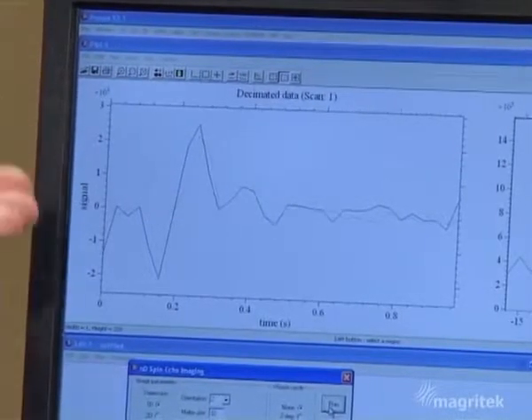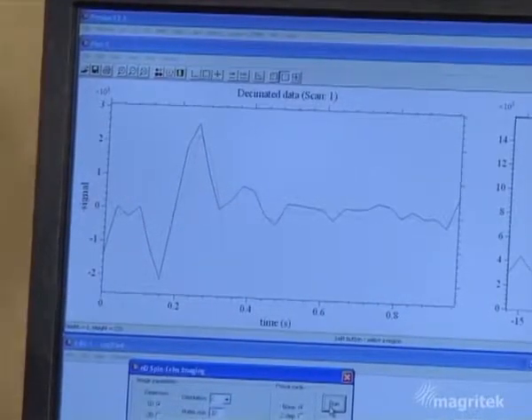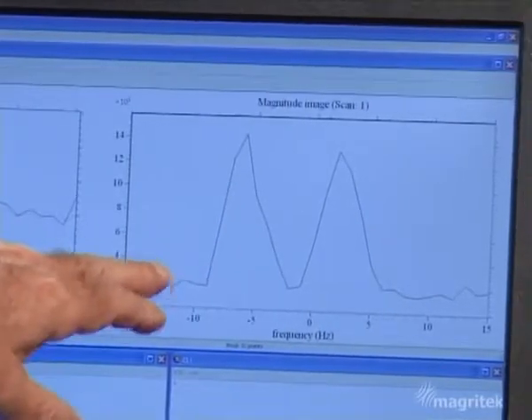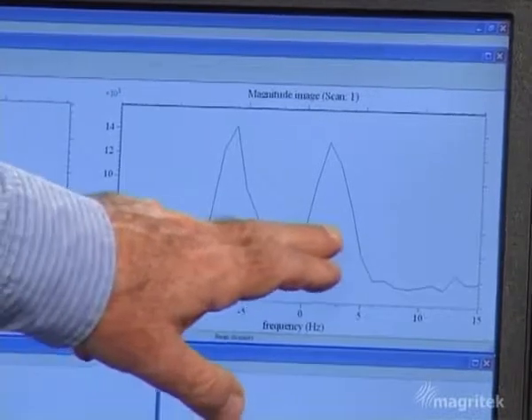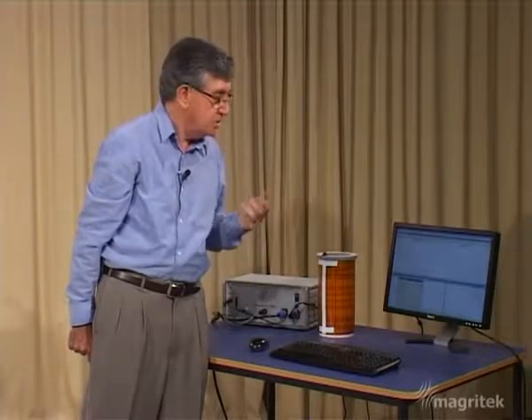What we have to do is to Fourier transform this echo signal in order to obtain the spectrum. And here it is in the right-hand panel. Indeed, we do see two peaks, one on the left, one on the right, corresponding to a lower frequency and a higher frequency, the tube at the bottom and the tube at the top. And of course, this frequency axis along here is simply a position axis, because of that simple relationship between frequency and position, which is created by the linear variation of magnetic field caused by the gradient coil.